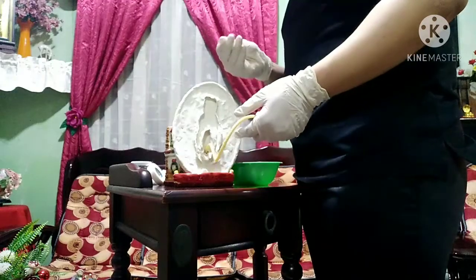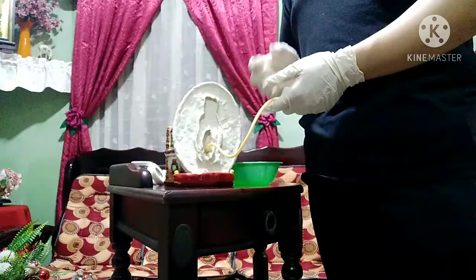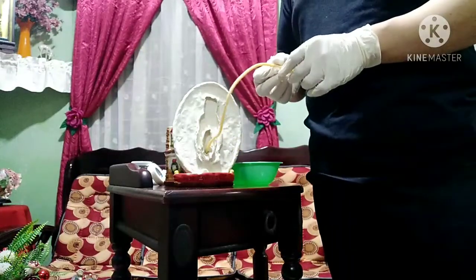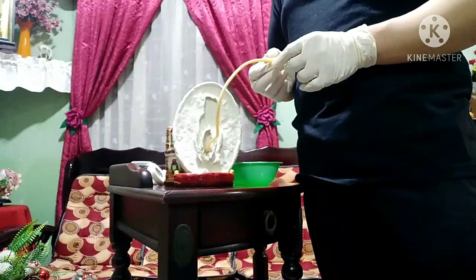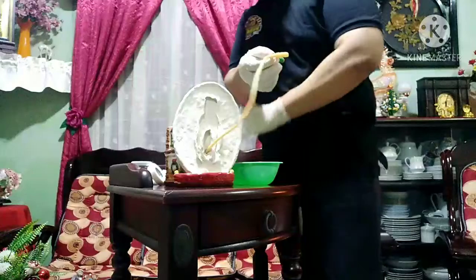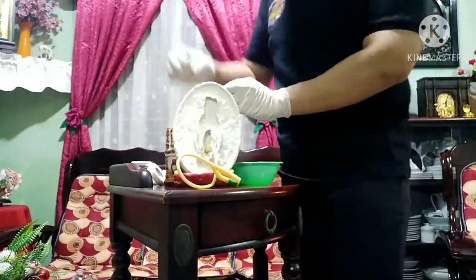Now, step 18, inflate the balloon by introducing sterile water to the injection port of the catheter. Since it is already in, we just need to take the syringe.